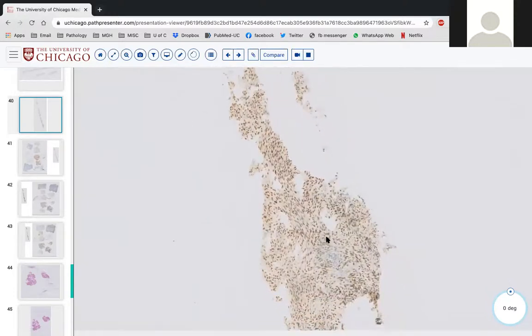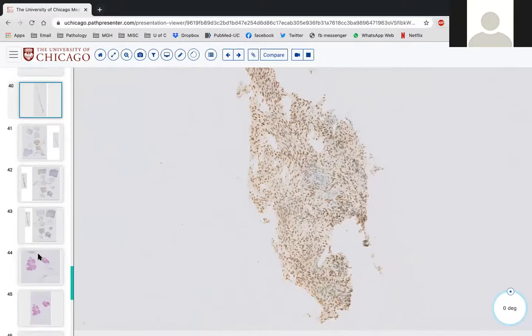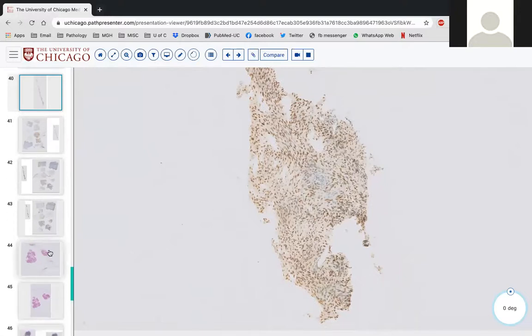I don't know what the convention is for this, but what did we say on case 1? Just kidding, or case 2? You don't ever have to stick your neck out on a salivary gland, right? So okay, then I'd probably keep low grade spindled tumor and elaborate in the comment. Exactly, and that's exactly what we did.